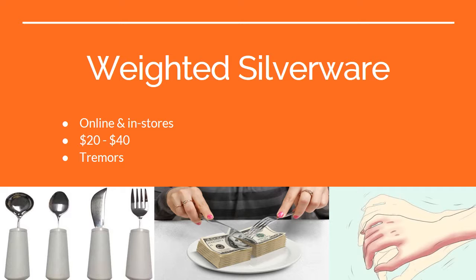So, to purchase weighted silverware, you can go online via Amazon, or there are tons of therapy supply stores that offer this product. Or if you would rather go in person, I've seen them at Walmart, Target, Meijer, at a lot of the big stores. I've even seen them at Costco and Sam's Club too. So for the cost, from my own research, the average weighted silverware set, which includes a knife, fork, spoon, and soup spoon, can range from $20 to $40, and that's just for one pack of 4 pieces of silverware.